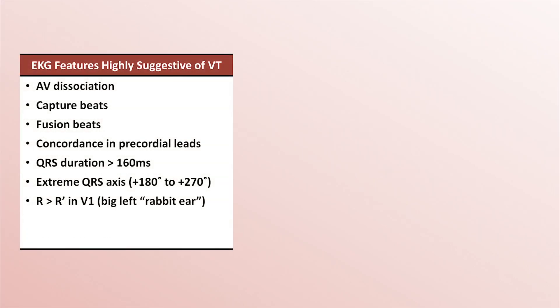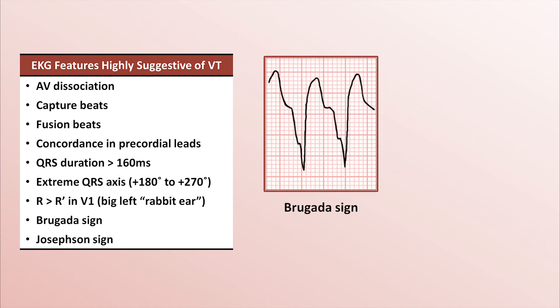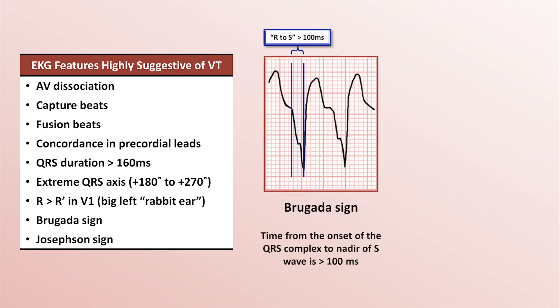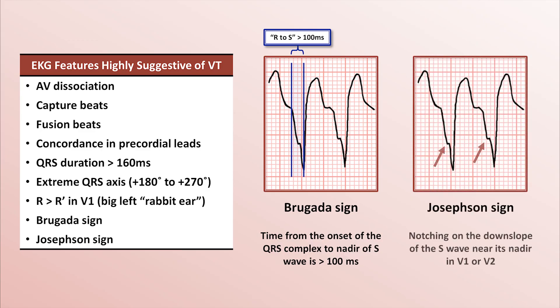Two final features are Brugada sign and Josephson sign, both of which are demonstrated here. Brugada sign is when the time from the onset of the QRS complex to the nadir of the S wave — known as the R to S duration — is over 100 milliseconds. Josephson sign is notching on the downslope of the S wave near its nadir in V1 or V2.